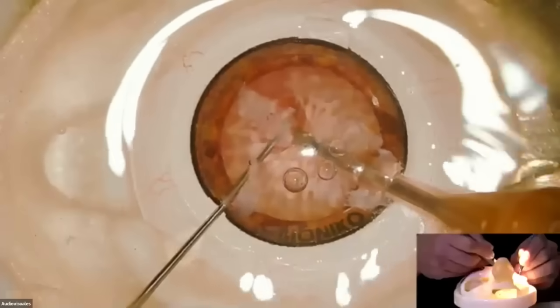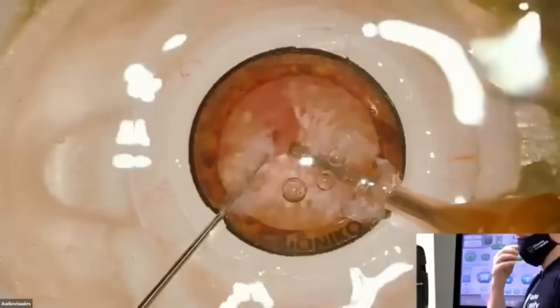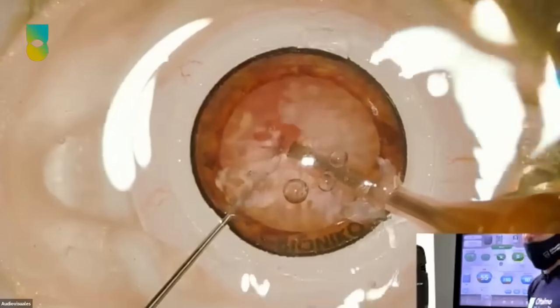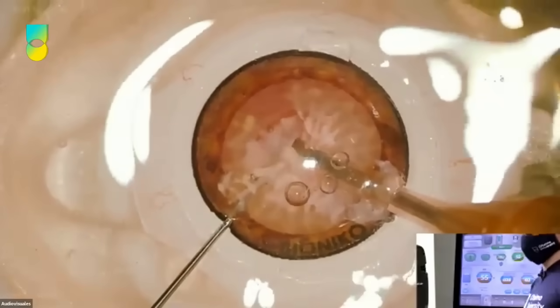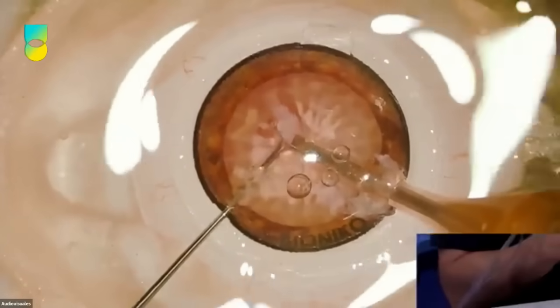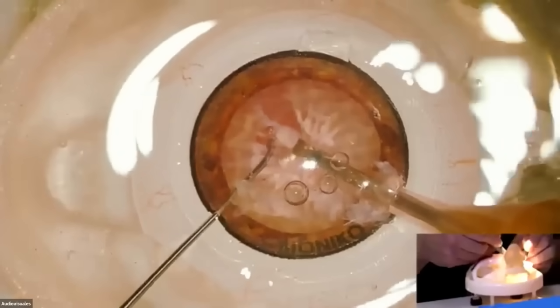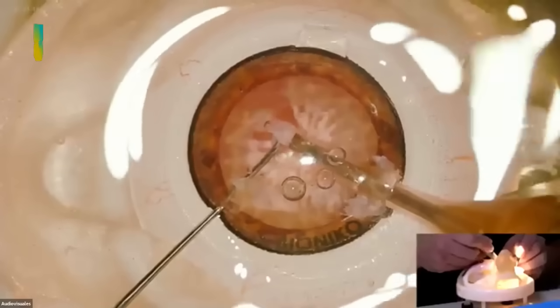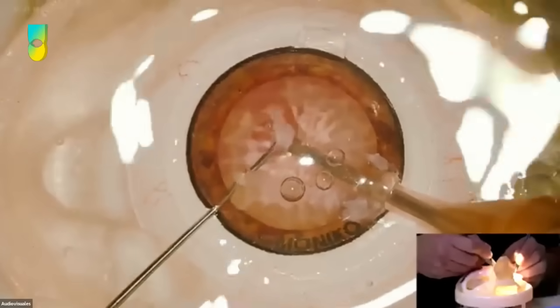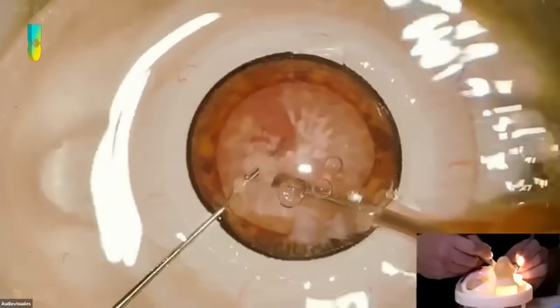Now we need to change the quadrants because you need more vacuum. And we're going to start doing something we love, the 2-3-2 we talked about, right? We're going to do some vacuum. You're going to have the fragment and you're going to do position 3. Slowly 3, 3. The sleeve position is even important. As you can see there, the sleeve is too close to the actual tip. So do position 3. You're not doing position 3. I'm not hearing the 3.